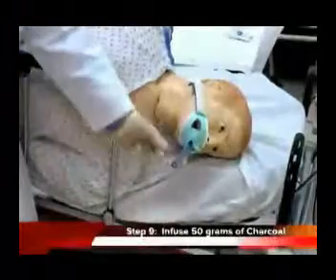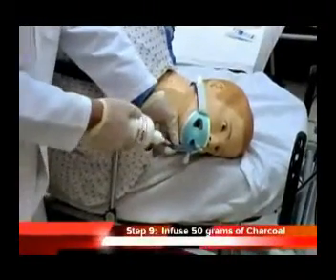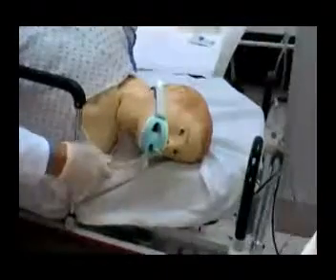Step 9. Administer 50 grams of activated charcoal slurry through the OG tube. In children, the dose is 0.5 to 1 gram per kilogram. Step 10. Pull the tube back out and you are done.